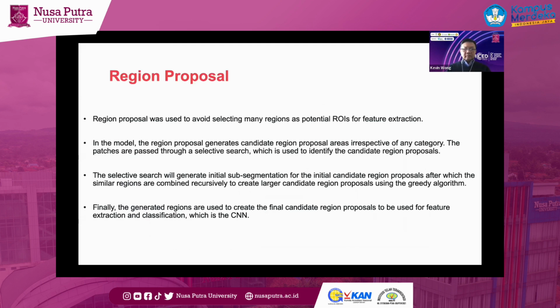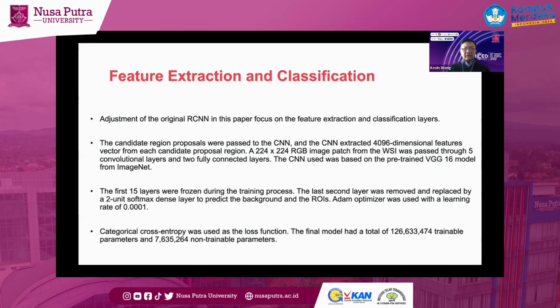So over here, the region proposer basically is trying to select all the regions. But one of the things that I want to highlight here is the region proposer step is important because, for you to identify the candidate, you have to be as confident as possible. So that is why the region proposer is important. And normally this one here is done by some kind of greedy algorithm. Okay, I'm going to more or less skip this one. All right, there's a lot of details here, but if you're interested, let me know. I can give you the papers, and we'll have all these technical details in there.